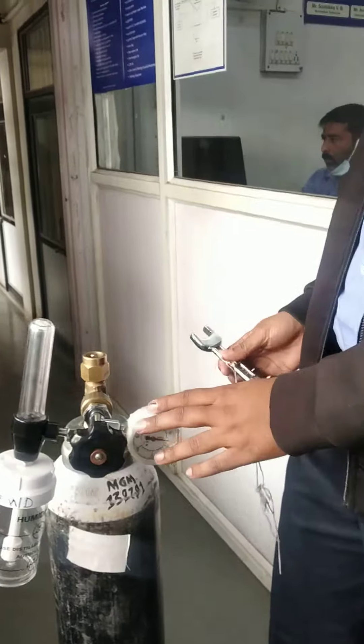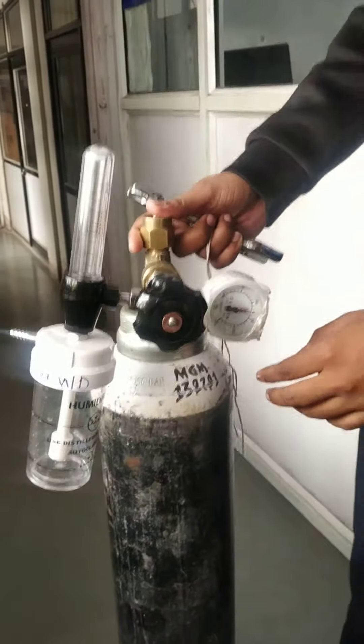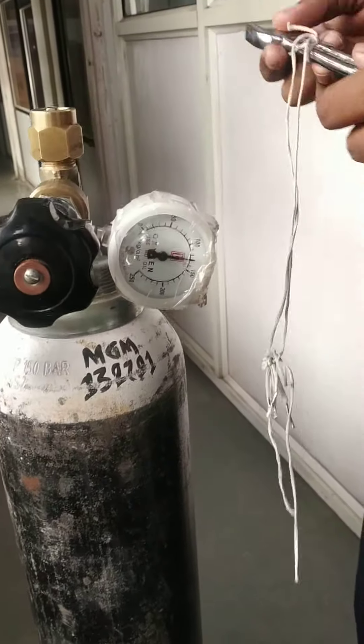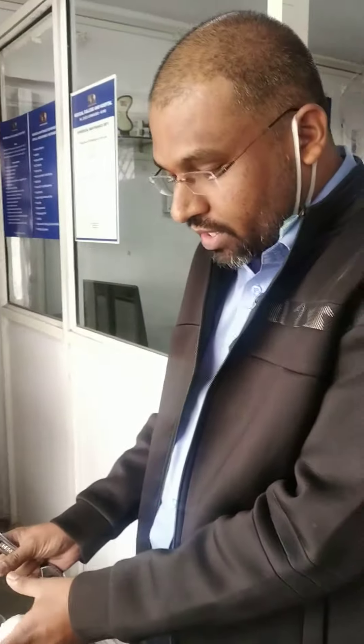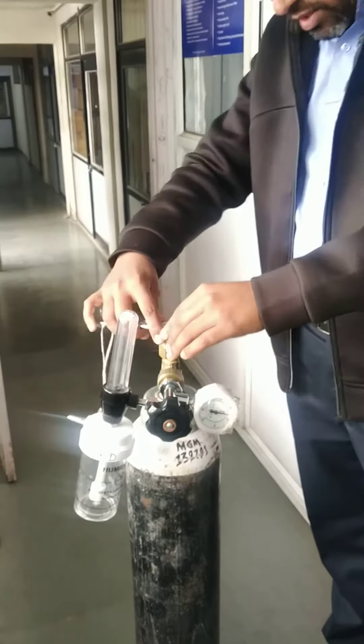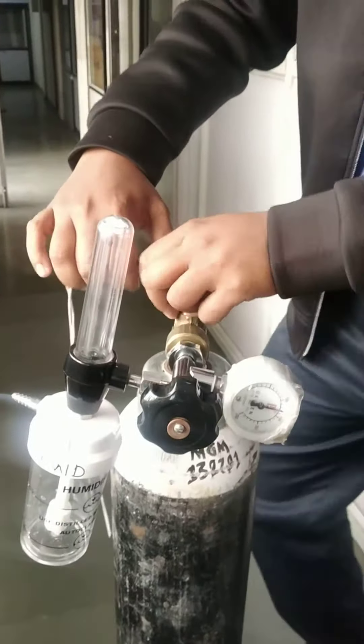When you have to release oxygen or change the cylinder, what do you want to do? Simple — place it on top of the cylinder properly, then you can fix the cylinder.